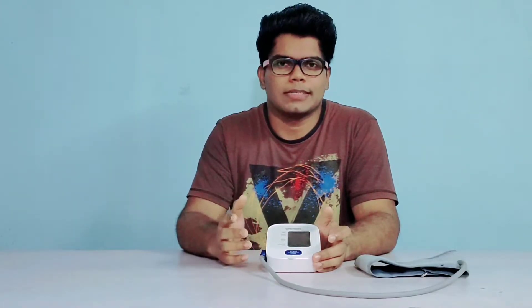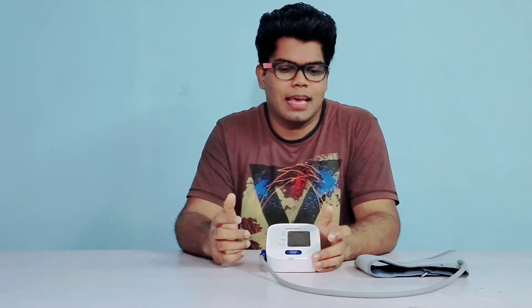Here is my review after using this product for 90 days. First let's discuss why Omron — why most of the doctors suggest this brand over any other. I think it's due to several reasons. First being the brand value.